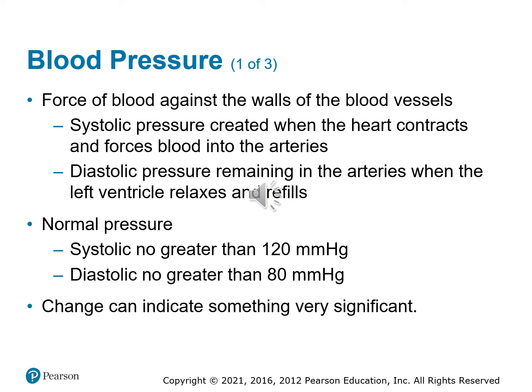The first blood pressure truly is best to always take where you're listening to it, because you know 100% it's accurate. Machines are good once you have that baseline established to compare and know where the changes are, because then it frees up your hands. But there's nothing wrong with continuing to do blood pressures the old-fashioned way with a stethoscope.